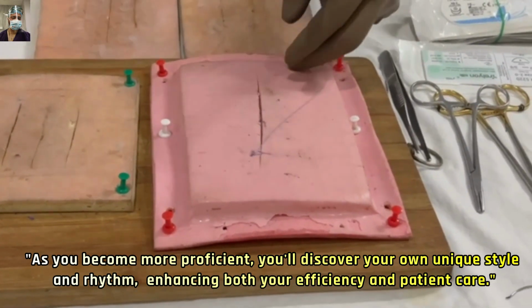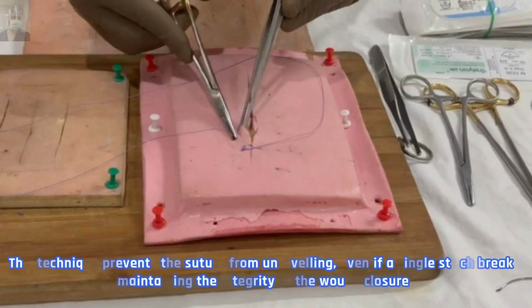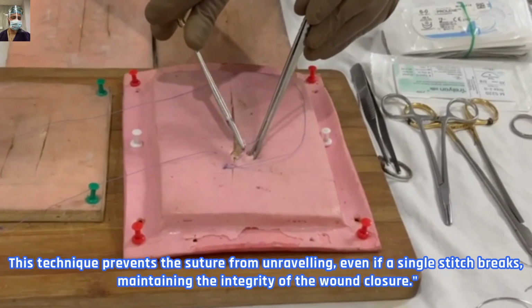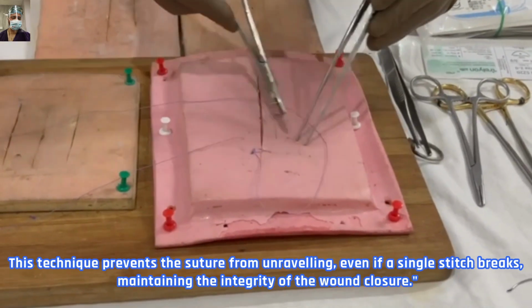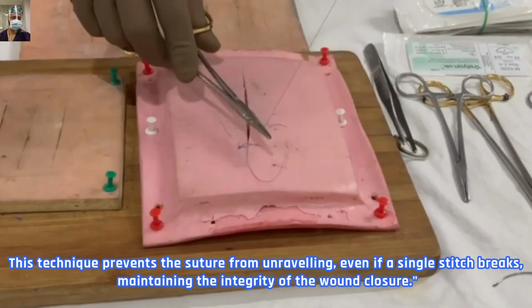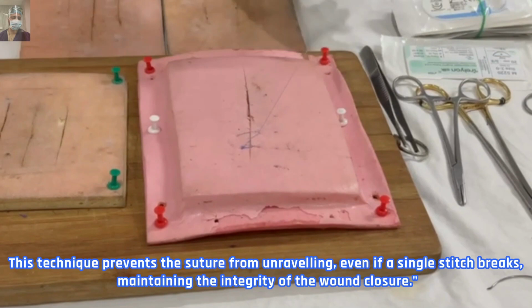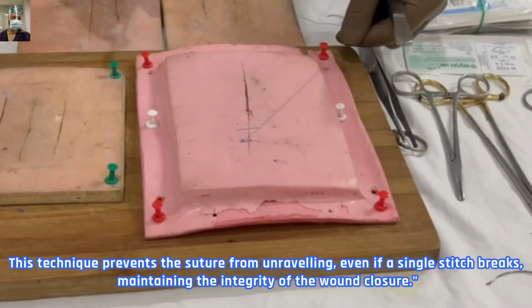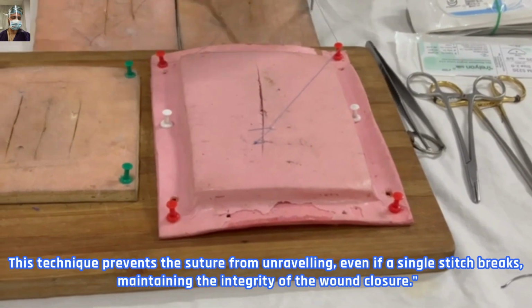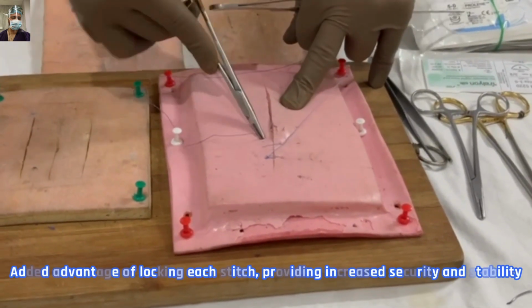So you simply follow this technique: you make a loop, this C loop towards you, and then you come inside the loop. It's the same technique which we follow while doing the lap suturing. And one of your assistants has to keep this thread under tension. Here I am using the pin for keeping it under tension, and you keep progressing. Again, just notice that I am following this loop and coming inside the loop and progressing as required.